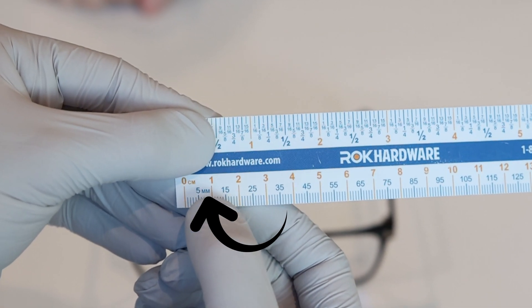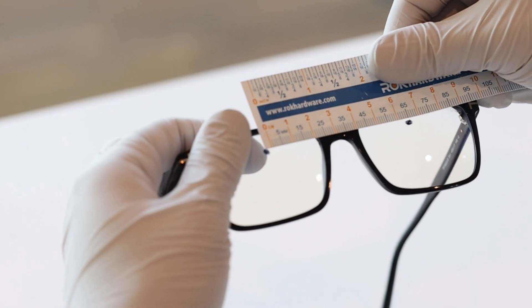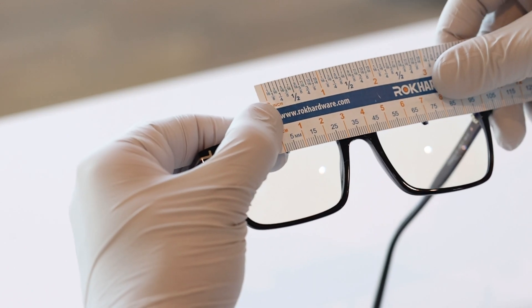Now that you've dotted both your lenses, you're going to grab a ruler and using the millimeter side, you're going to measure from left to right the center of each of those dots. The measurement you get at the very end is your pupillary distance, or PD.